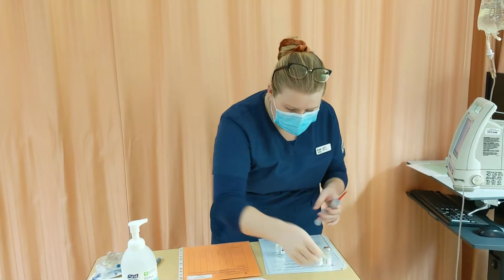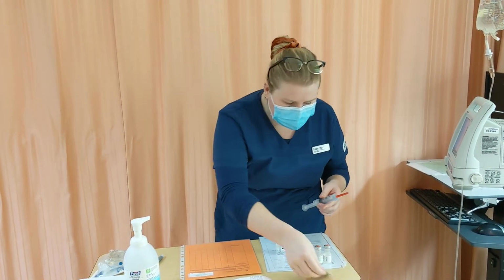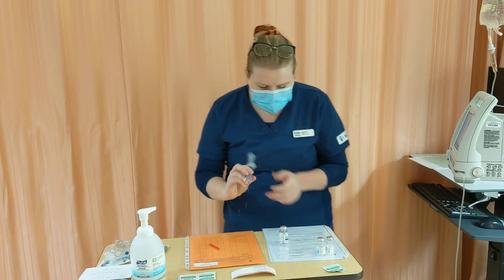Okay, so once I've done that, I'm going to swab the top of this one for 30 seconds in a circular motion and let it dry for 15. And then I'm going to reconstitute.